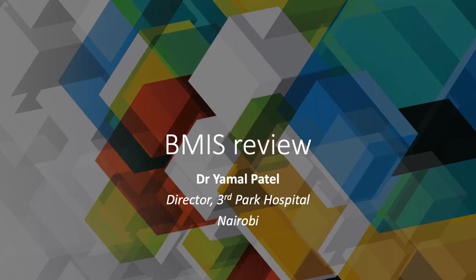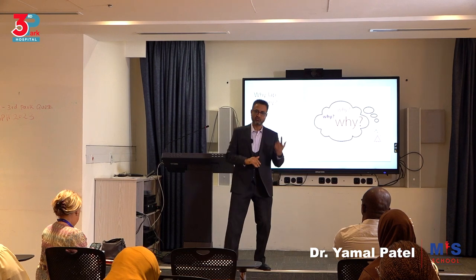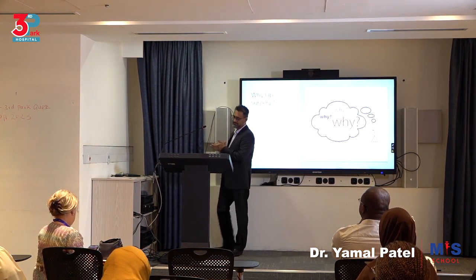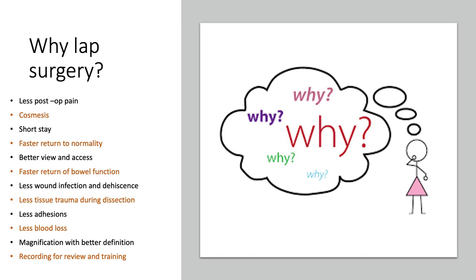This will probably be a bit long, but as I've said, it's important that we finish all this before we move further. So you must have discussed why laparoscopic surgery, why MIS. There are very obvious causes here. We have less post-op pain, cosmesis, which should be mentioned last though, short stay in the hospital, faster return to normality, a better view and access.